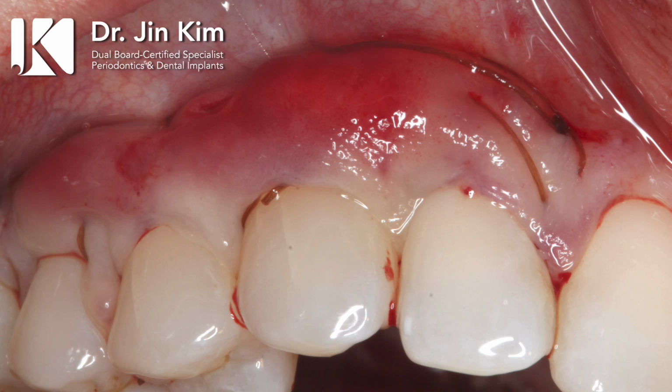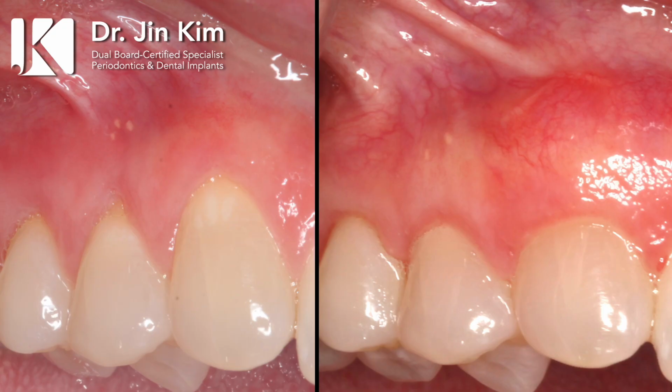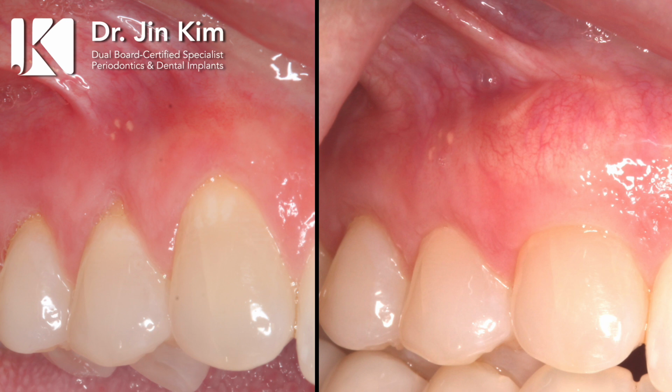So here is the actual site where the graft was done immediately after the surgery. And the next image shows the 3 weeks follow-up, showing an extraordinarily good healing. And here is the side-by-side view of this area, and again, a more matured area.